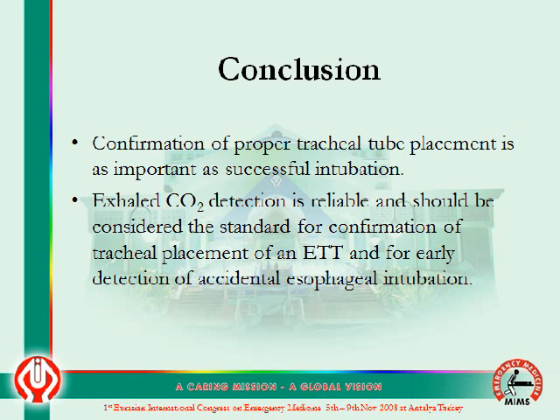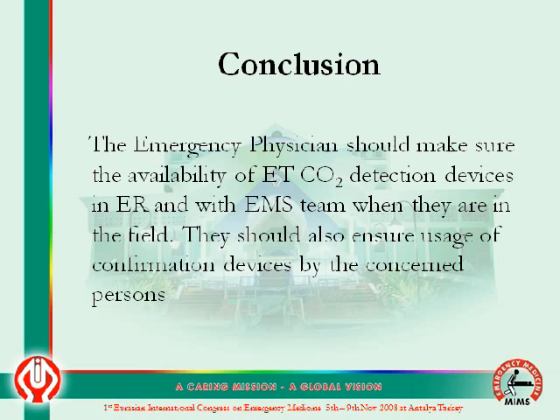So, in conclusion, the confirmation of proper tracheal tube placement is important. It is as important as a successful intubation. Exhaled carbon dioxide detection is reliable and should be considered the standard for confirmation of endotracheal tube placement and for early detection of accidental esophageal intubation.